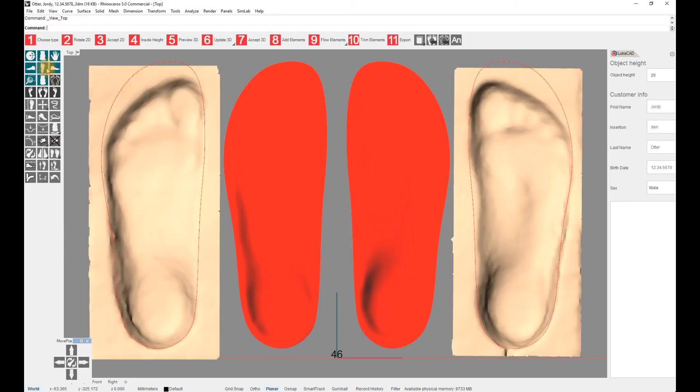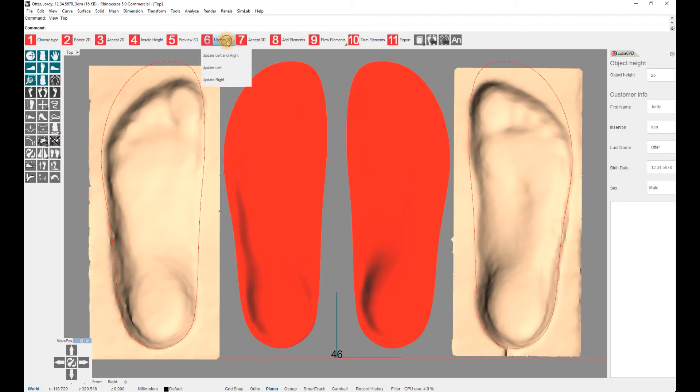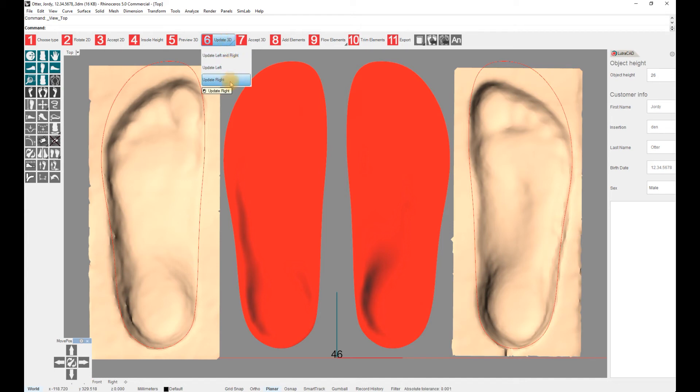If the insole is not as intended and the scan has moved, the preview needs to be updated. This can be done with step 6, update 3D. It is possible to choose only one side to speed up the process.